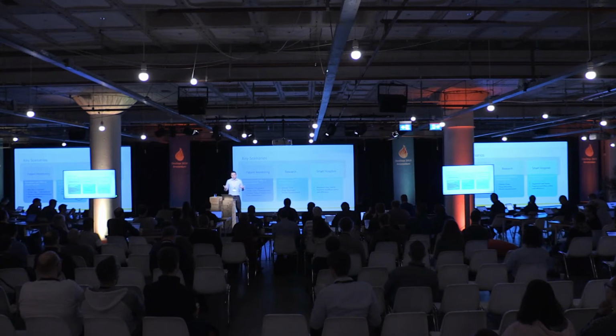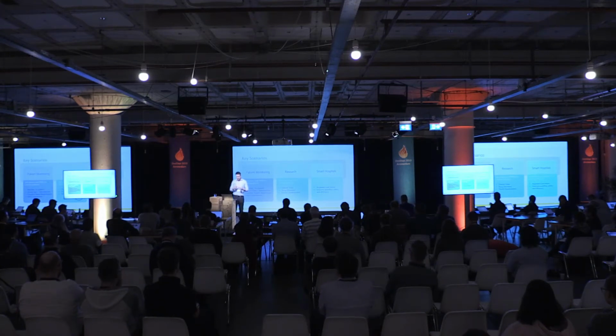So what would you use this for? So there's a couple key scenarios. One of them would be patient monitoring, which in and of itself can mean many different things. So you can have remote monitoring of your patients, particularly important for home care or telemedicine. And it gives us an opportunity to extend the reach of the clinic and keep tabs on patients, make sure they're doing well, and potentially intervene before adverse events occur or severity escalates.